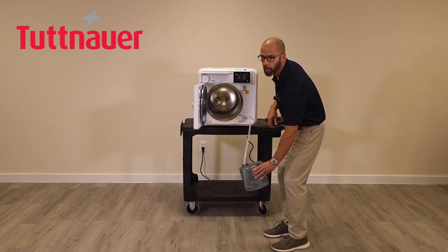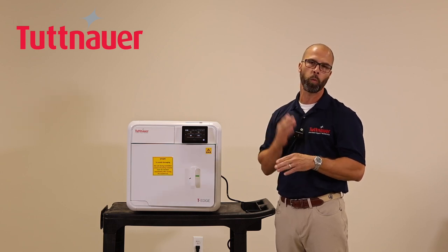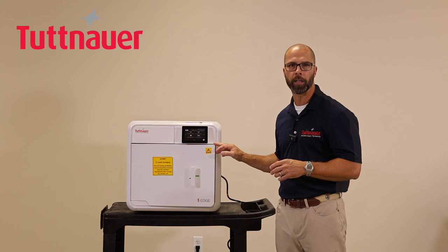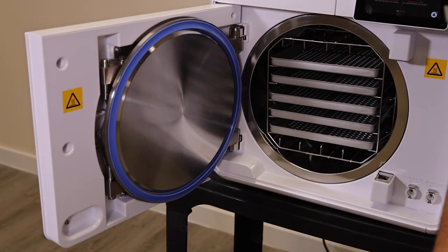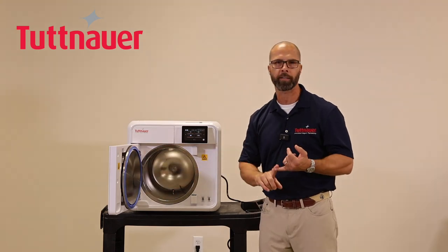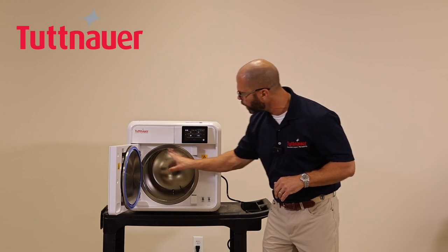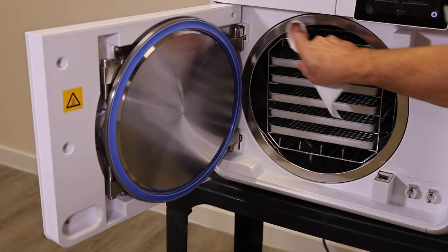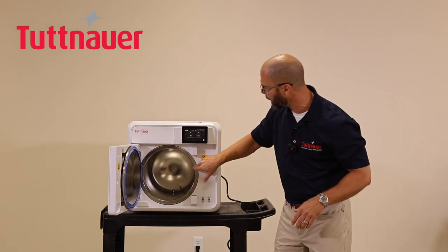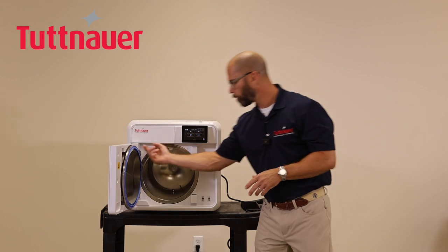Maintenance is divided into daily, weekly, monthly, and periodic tasks. For daily maintenance, use a lint-free cloth with mild soap detergent to clean the door gasket on the outside and underneath the lip. Inspect it carefully for any cuts, indentations, or marks — it should be clean and pristine. Also wipe down the door flange to ensure a proper seal. That's all that's required for daily maintenance.